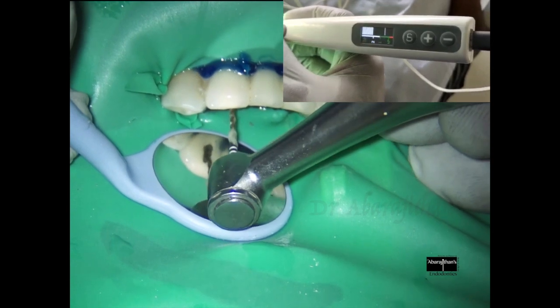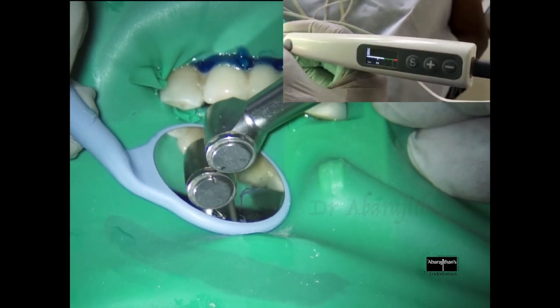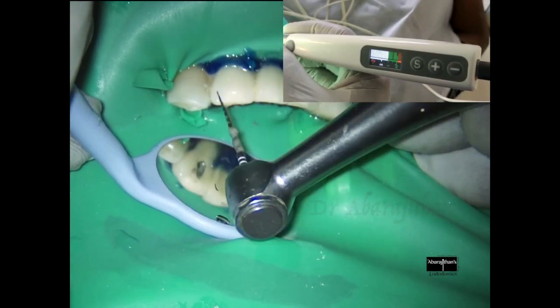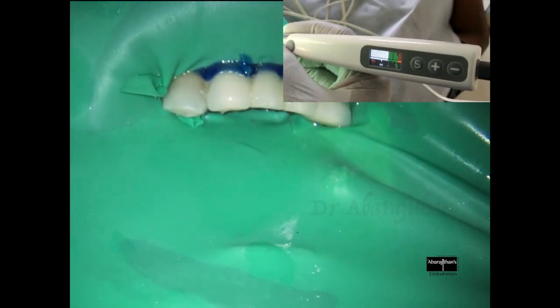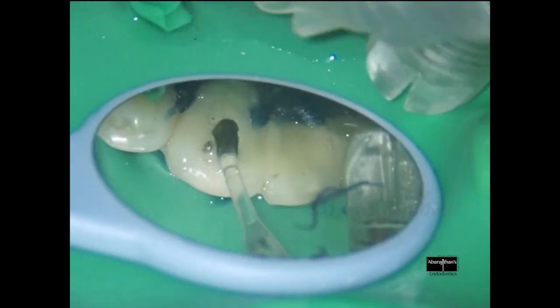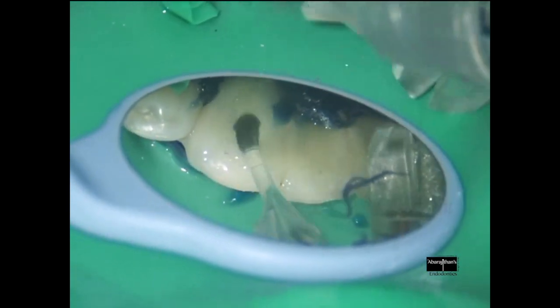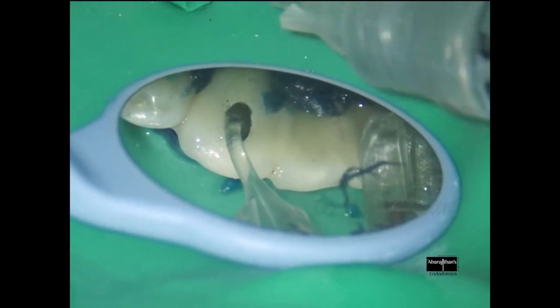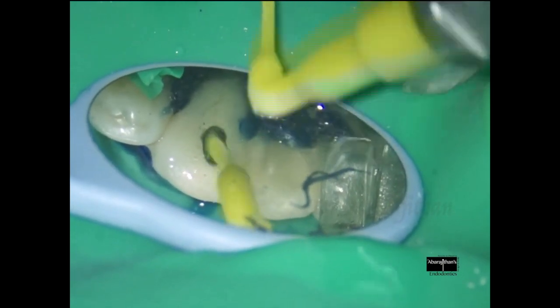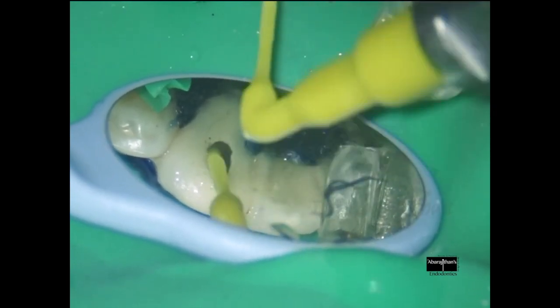Following this we proceed with rotary instrumentation of the apical third of the canal. During rotary instrumentation I do not use manual K-files for negotiation or glide path — we directly go with rotary using the endo motor that has an integrated apex locator function. The moment my endo motor with the integrated apex locator shows I reach the apex, I stop and proceed with my irrigation. For the mainstream of irrigation I prefer to use the 30 gauge irrigation needle.